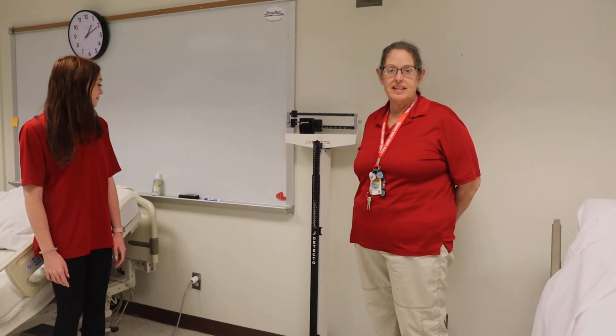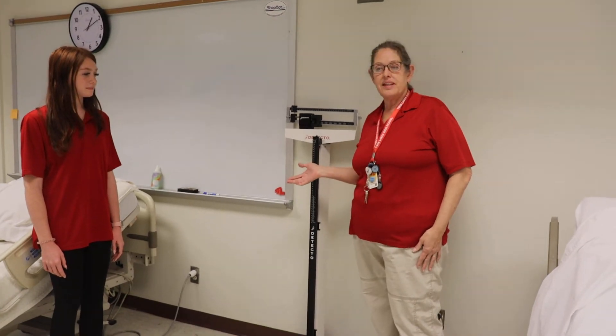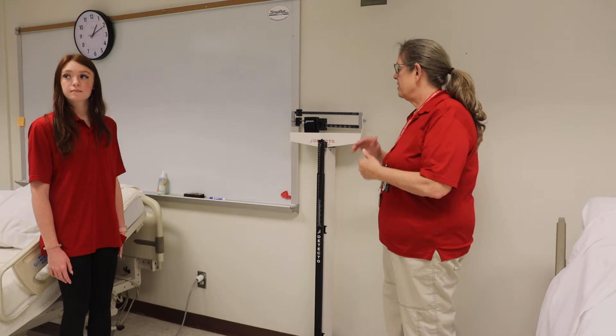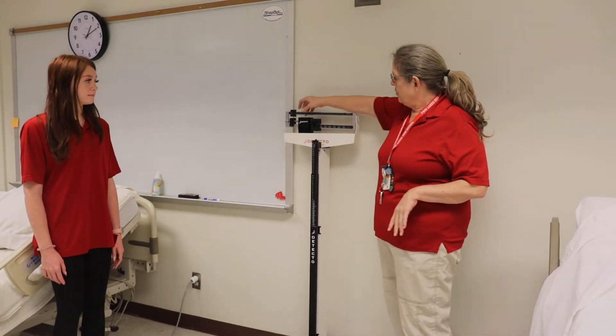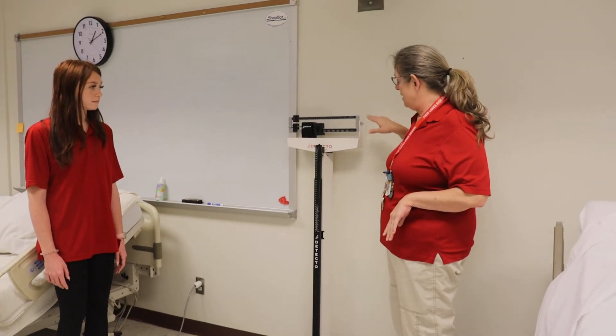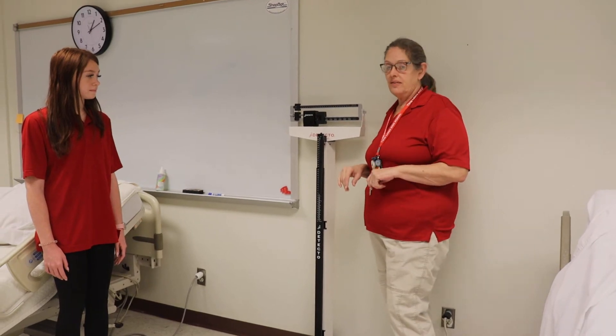This is RCP number 17 and it is weight. I use a physician standing scale here in the classroom, but regardless of whether you have a digital readout scale or a standing scale, you want to be sure and zero them prior to use. So before you put your patient on it, you're going to take this one over to zero and it should balance. With a digital, you're going to zero the scale itself.